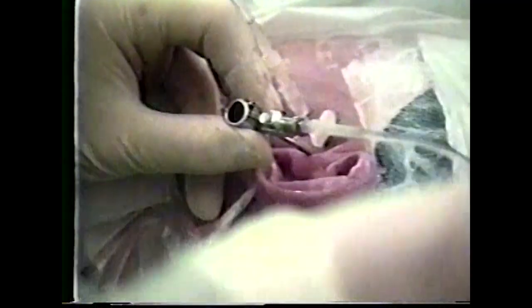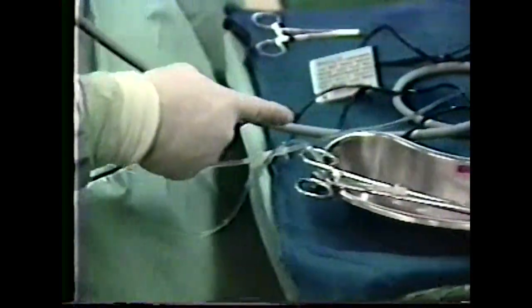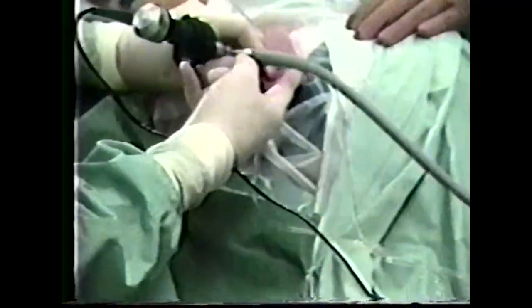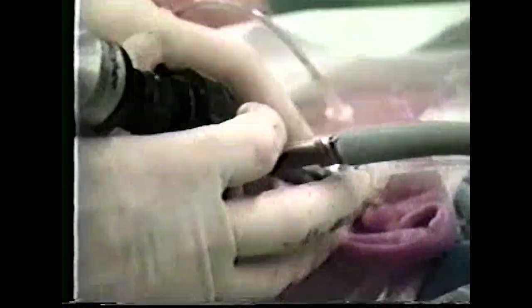At this point, inflow tubing is attached to the infralateral cannula. This is flushed free of bubbles while the camera and arthroscope are inserted. The syringe is removed from the outflow tubing and inflow is established through the infralaterally placed scope. This directs the fluid away from the end of the arthroscope and helps keep the visualization clear. Outflow is reestablished through the anterior lateral needle and is confirmed at the outflow basin.